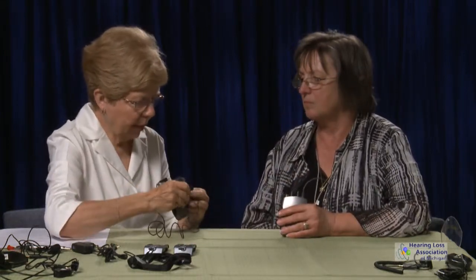And I'm going to go ahead and, are you on your telephone coil? Okay, and I'm going to just hold the lapel mic for right now. And are you able to hear me speaking through that? Okay. Now, one of the things is that generally you're going to have to instruct the speaker on how to use the microphone.